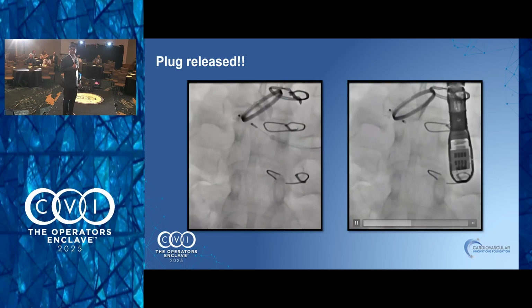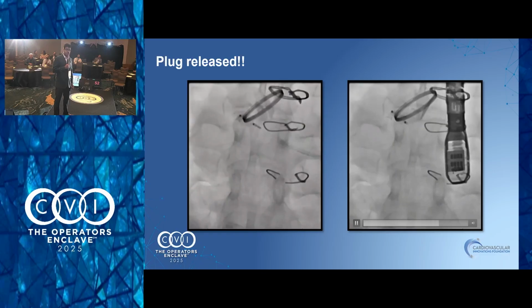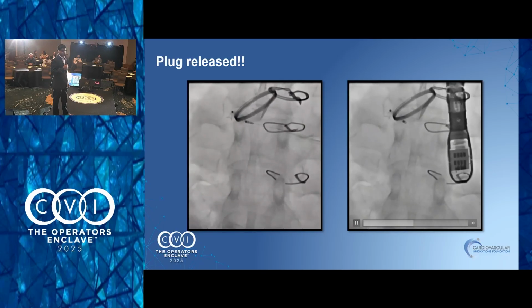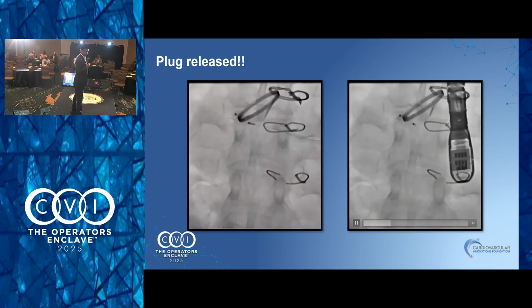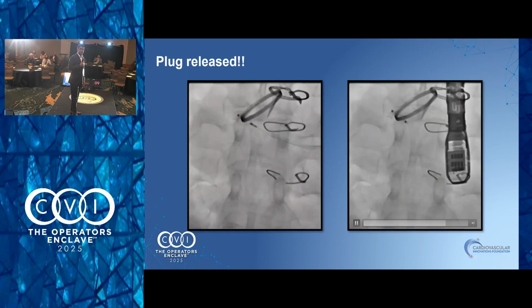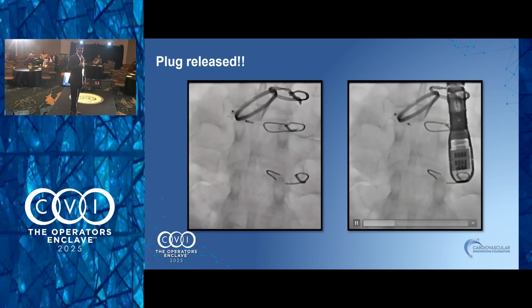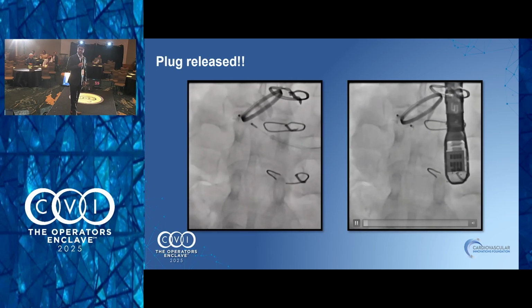Otherwise, whatever. But if you were to do an anchor, this is a 6 French sheath? 6 French sheath, so you could easily have an anchor wire in there with a small device. You can even just leave a coronary wire if you wanted to, so you didn't have to rewire this. Yeah, usually we do that for all the PVLs or everything else. But I think in this case, once the plug came out, it was like, okay, we're done now. A lot of tugging to make sure it was anchored.